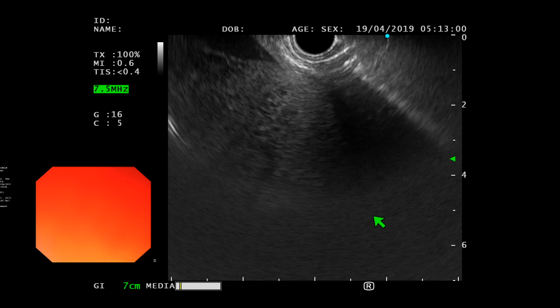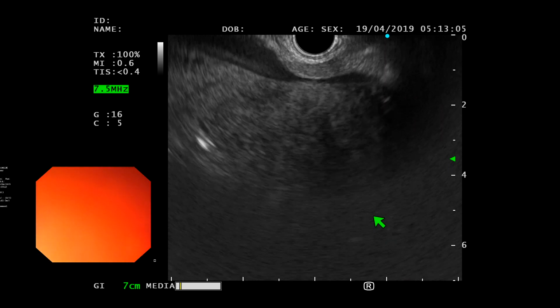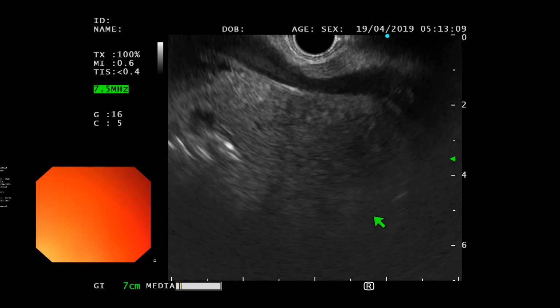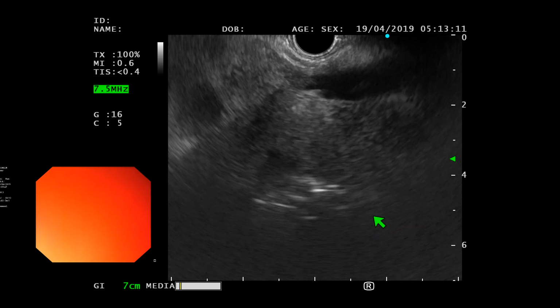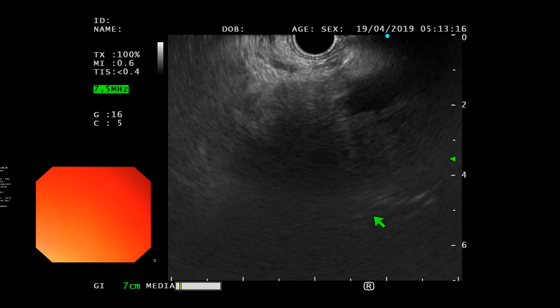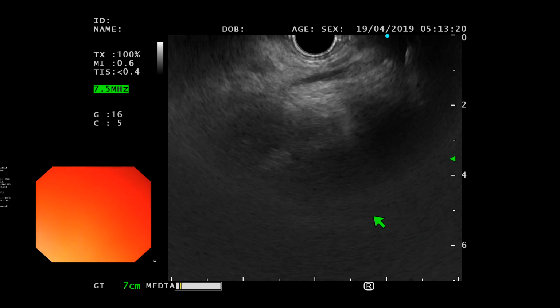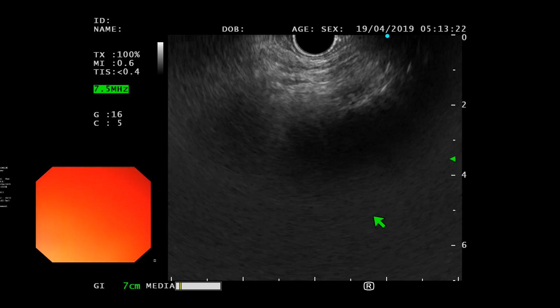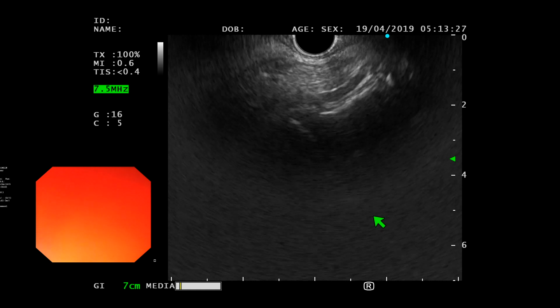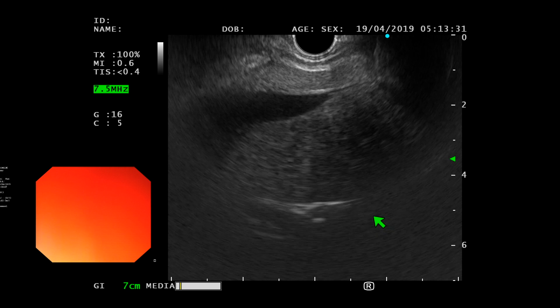Yeah, and I don't think we have necessarily made it as stepwise in the US yet. I know there have been a couple of studies out of Colorado that they've talked about reaching competency. But you're still in the liver. The pancreas you're seeing, you're seeing from the left side. I guess the question becomes, at what point does one say, okay, in the interest of the patient, one has to move towards completing the procedure?